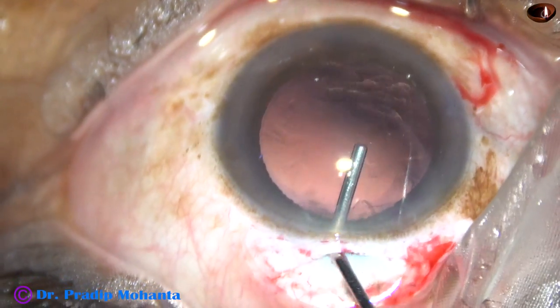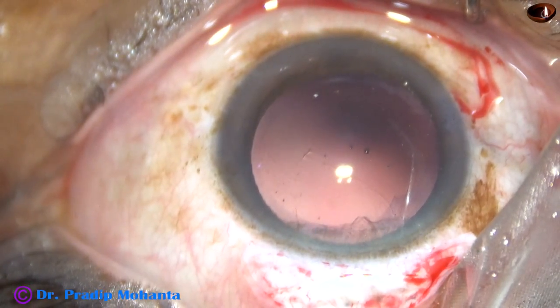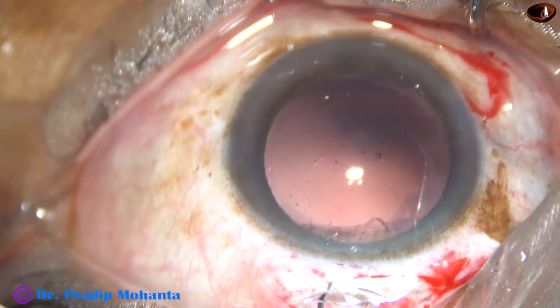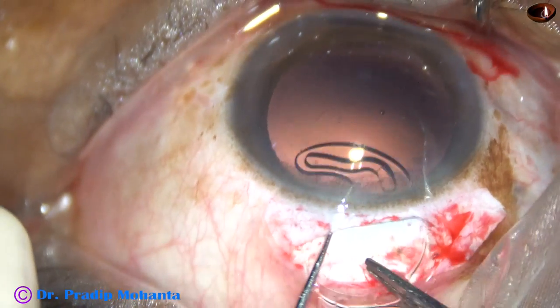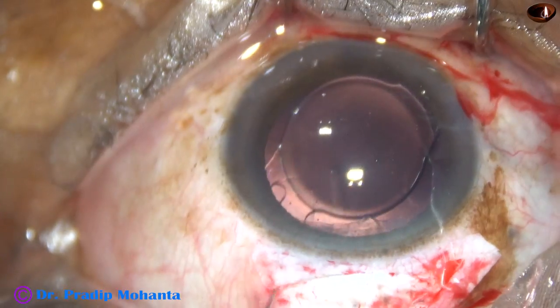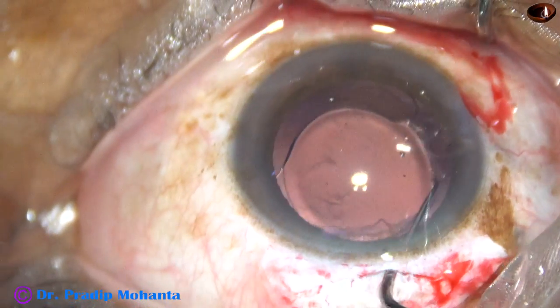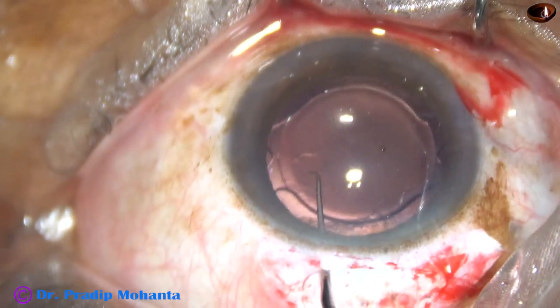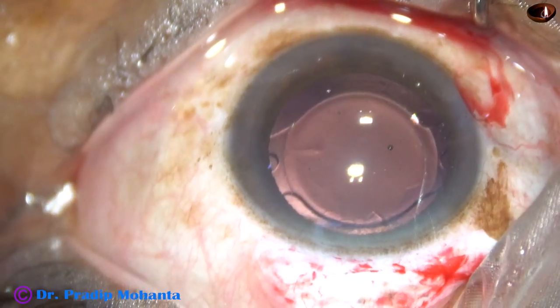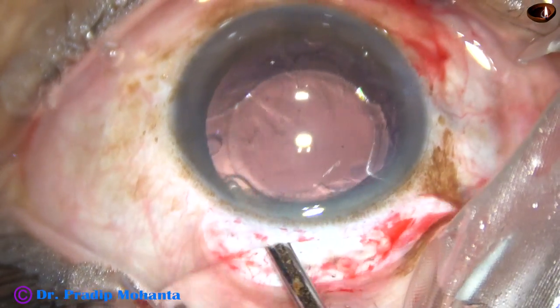Now this is 2% HPMC visco filling the capsular bag as well as the anterior chamber. See how to implant a foldable intraocular lens: take a Sinskey hook in your left hand, depress the lens, and push the lens with the Sinskey hook. The Sinskey hook depresses the haptic-optic junction and the lens goes into the capsular bag. Foldable intraocular lenses are easier to place in the capsular bag than a rigid intraocular lens.